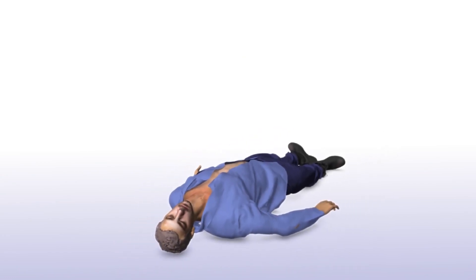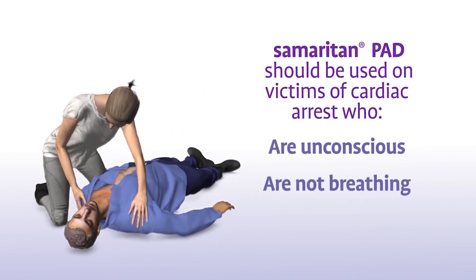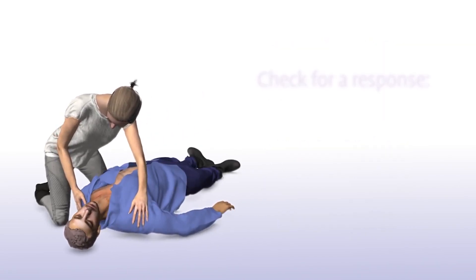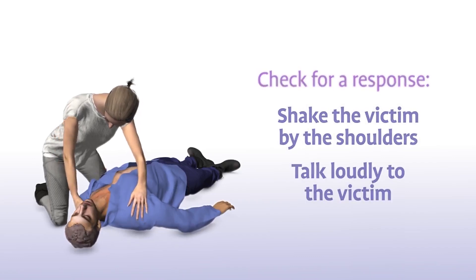The Samaritan PAD should be used on victims of sudden cardiac arrest who are unconscious, not breathing and have no pulse. Check for a response by shaking the victim by the shoulders and talking loudly to the victim.